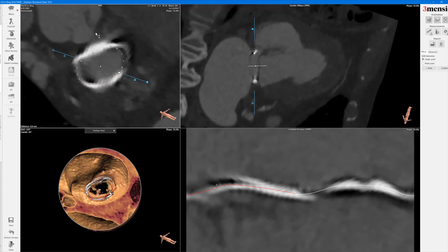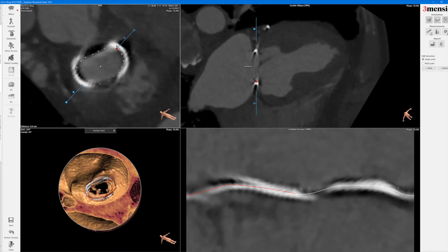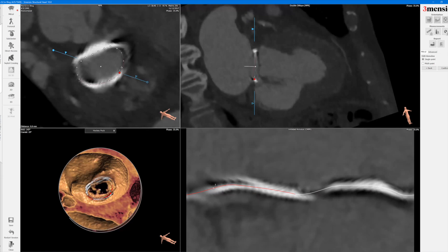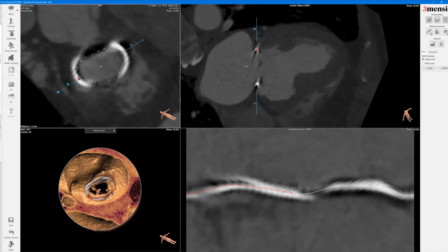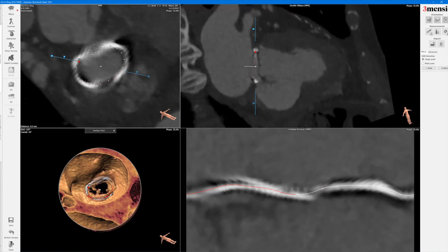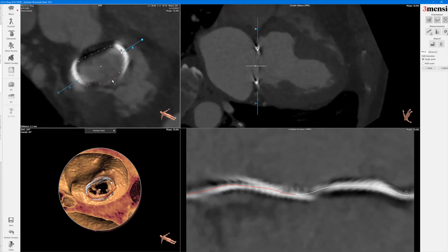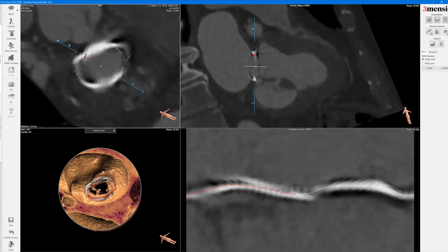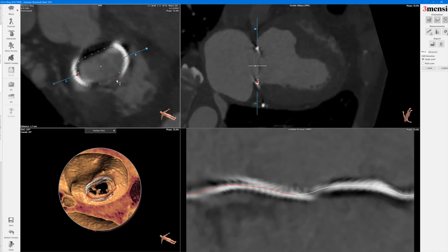On the top left panel you need to make sure that your dots are within the annuloplasty ring. It would be very helpful to know what size this annuloplasty ring is from either the operative report or by calling the manufacturer. For the mitral valve-in-ring procedure, you have to have a complete ring — otherwise if you only have an annuloplasty band, there's a risk of migration because there's no anchoring on the anterior portion, as bands typically go from trigone to trigone only.